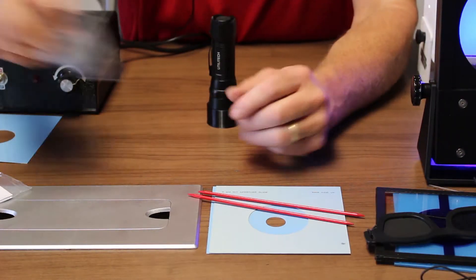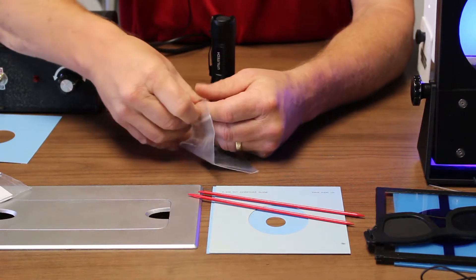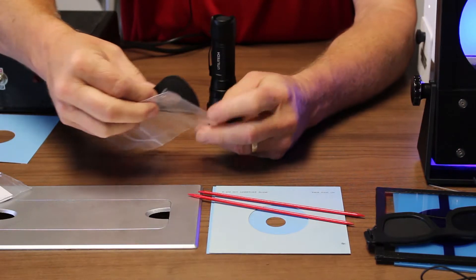Another trick to get the patient to see the brush sometimes is to change the lighting in the room. The dimmer the light in the room, the easier it is to see. Sometimes you'll even flash the light to get them to see it better.